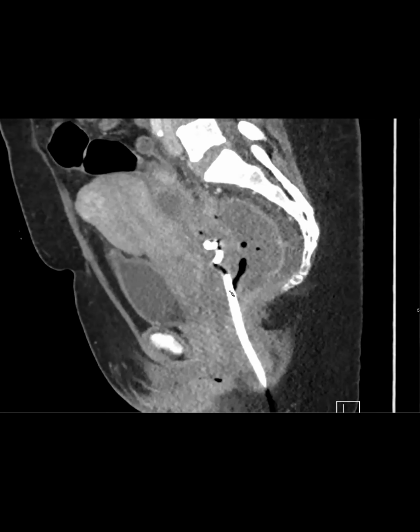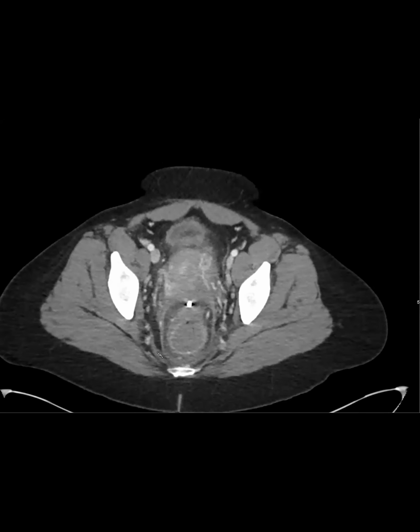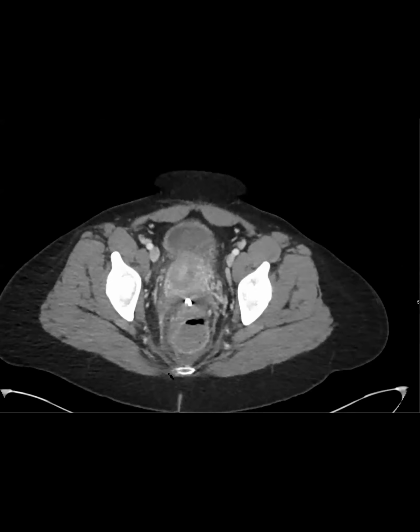So I was asking them about this, is it okay to go across the rectum? And they said, basically it's pretty much okay. Because it's draining in this direction, you're not usually getting translocation. And actually there's not even that much bacterial colonization of the rectum as it's getting closer to the exit area. And the TOA probably has a lot more multibacterial infection within it. And this is a lot more comfortable for patients than going percutaneously, transgluteally. And it doesn't have the risk of vascular or neurovascular injury.